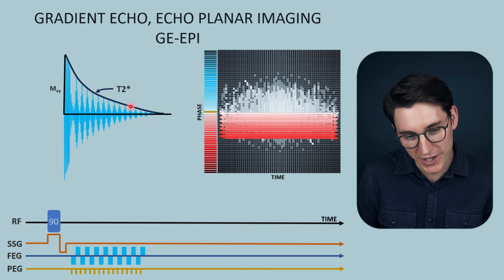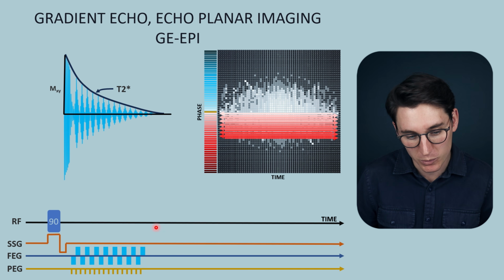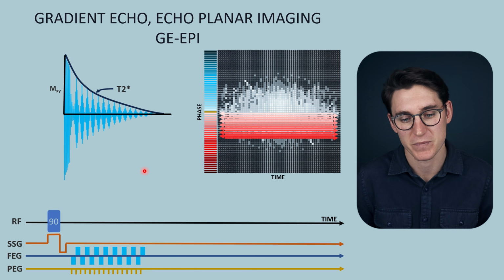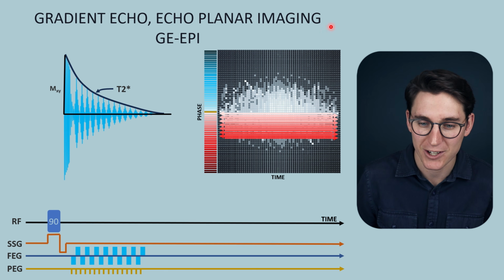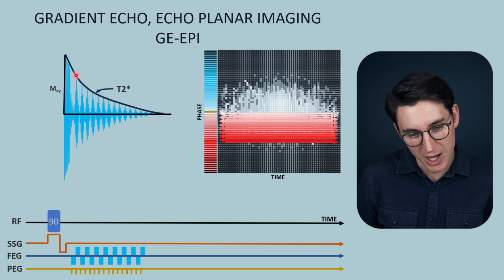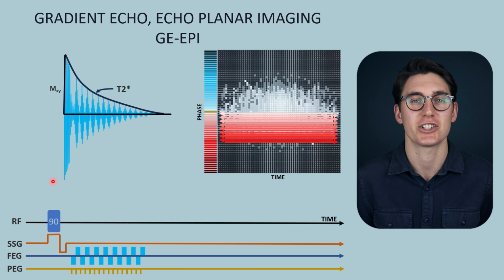We will get to a point where the level of transverse magnetization is so small that it's not more than background noise. We're not going to get any useful information, and we will need to repeat this process. We will need to repeat another 90-degree RF pulse and fill a separate section of K-space. Now, if we fill multiple chunks of K-space at a time, that's what's known as multi-shot echo planar imaging. Now, in the example we're looking at here, we are sampling signal coming from a gradient echo. Each one of these is causing a repeat gradient echo to occur, and we are sampling free induction decay.